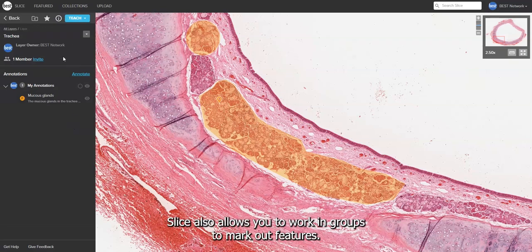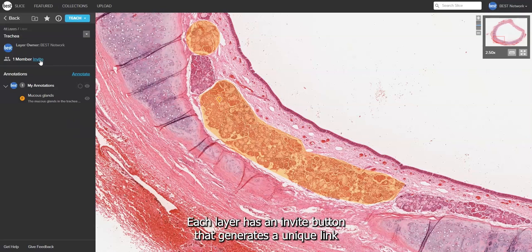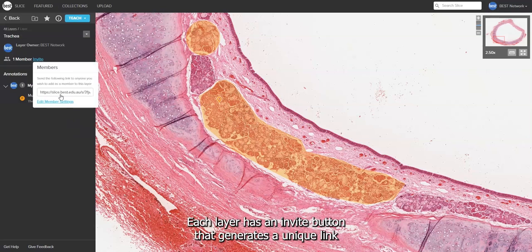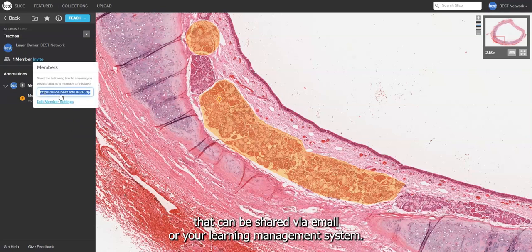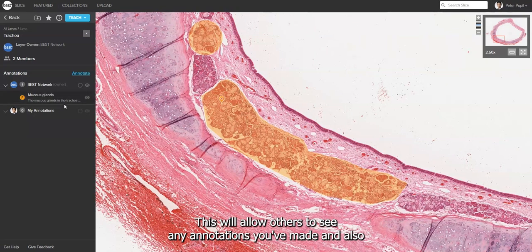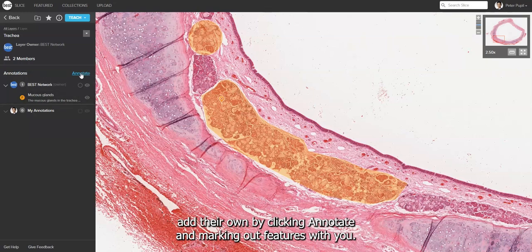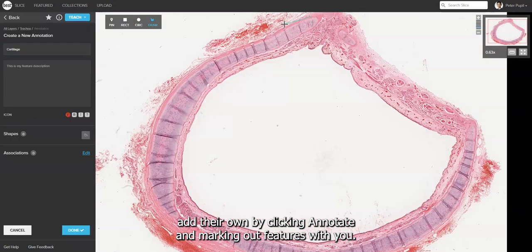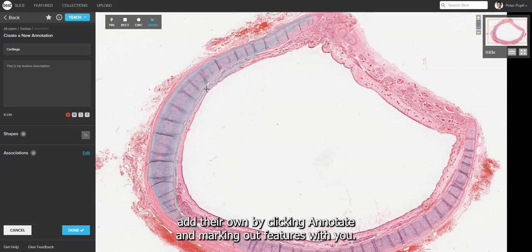Slice also allows you to work in groups to mark out features. Each layer has an invite button that generates a unique link that can be shared via email or your learning management system. This will allow others to see any annotations you've made and also add their own by clicking Annotate and marking out features with you.